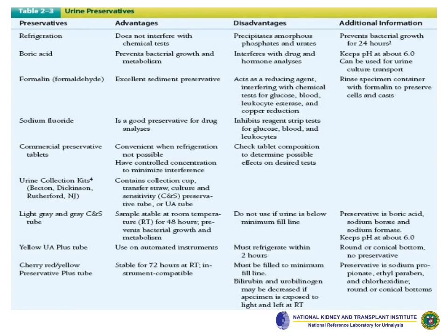This table shows the various ways to preserve urine. None of these is ideal as they affect the specimen in one way or another. You will have to choose one that is appropriate for the particular test that is requested.